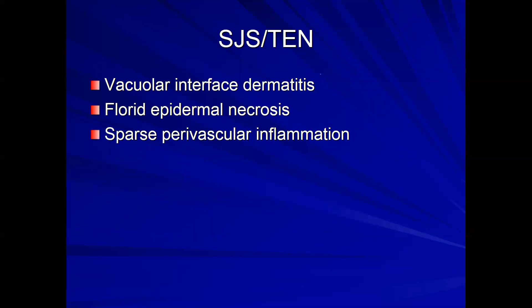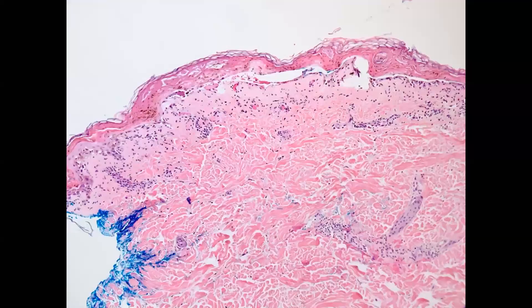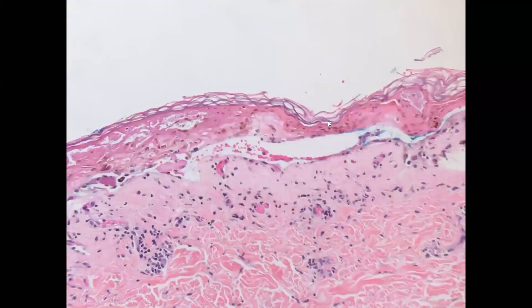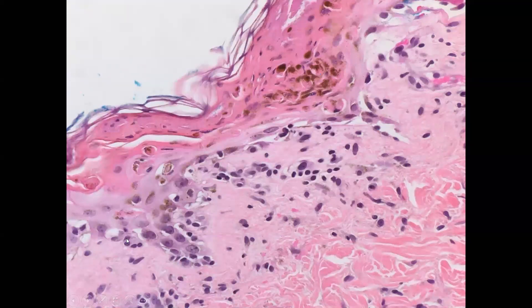SJS-TEN also falls in the subepidermal split category. It begins with an interface pattern: lymphocytes cause damage to the DEJ, necrosing the epidermis in a florid pattern. All you see is necrosis of the epidermis. Going up close, you see lymphocytes causing vacuolar alteration and necrotic keratinocytes at the DEJ — resulting in an acute hornified layer and acute necrosis of the epidermis. Those are the key features of SJS-TEN, distinguished on clinical criteria.